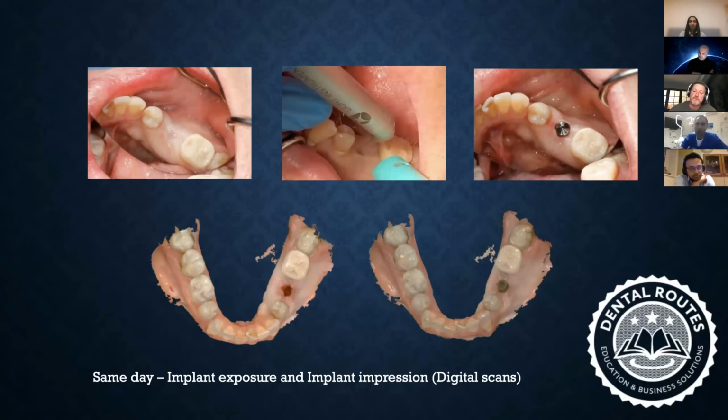One of the things that we show trainee dentists who are newly learning lasers is we make them cut a raw egg, just take the shell out with lasers, leaving the internal membrane of the raw egg intact without spilling the inside of the egg. And it is done completely in a predictable way every single time. Cool. Thank you.